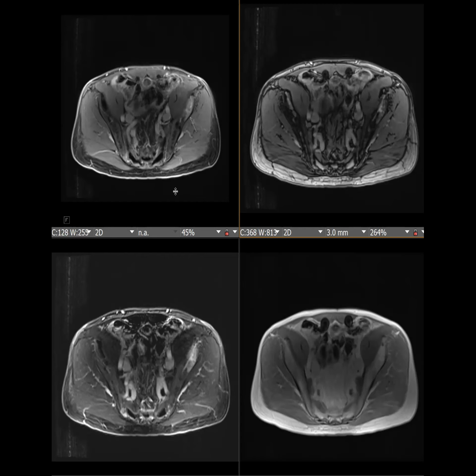His PSA was lower than would be expected in somebody who would have osseous metastasis, and there was no lesion on a recent nuclear medicine bone scan or a pelvic CT that was done about a month before this examination. So that was one case.